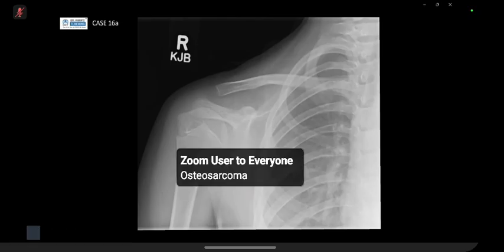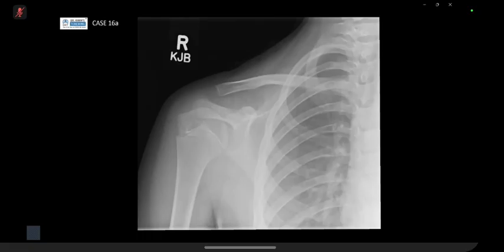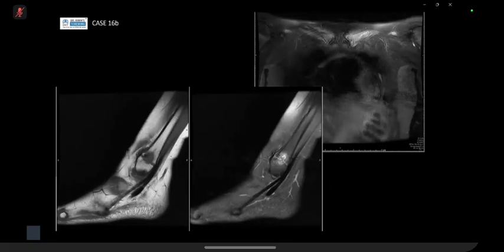Does the patient have anything else, like rheumatoid arthritis or any known condition? Nope. She presented with right-sided pain. Now she also has left-sided pain. So I've got more pictures. Yes, please.